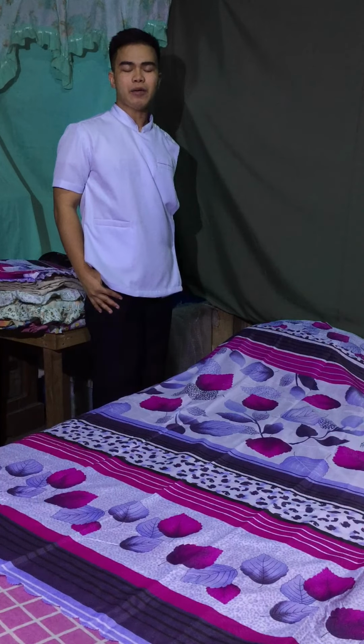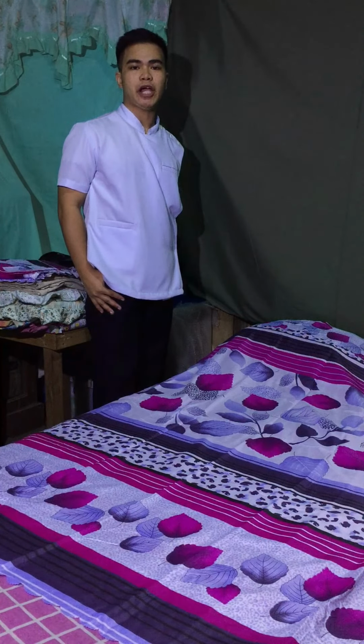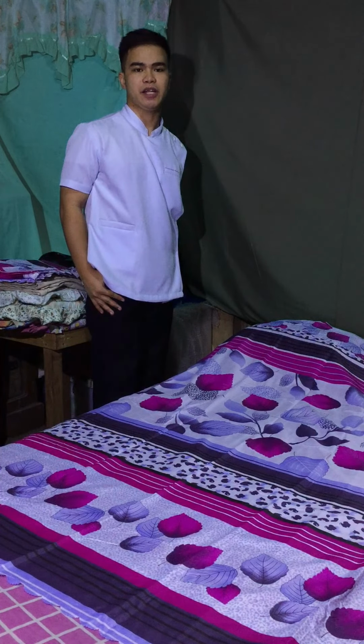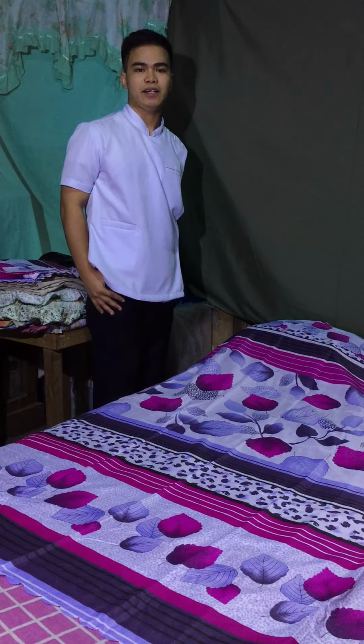Good day everyone, I am Loj Estrada from MSU 1 and today I am going to perform changing an unoccupied bed. So it is changing a type of hospital bed that does not have a patient in it. So this is to meet the patient's need by providing a safe, comfortable bed and for neatness and tidiness.